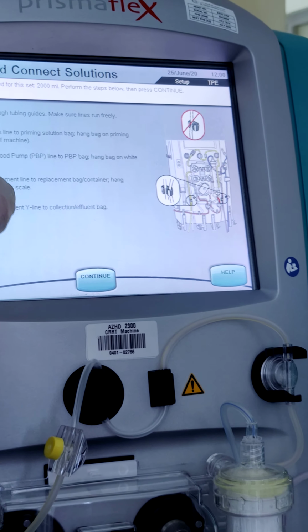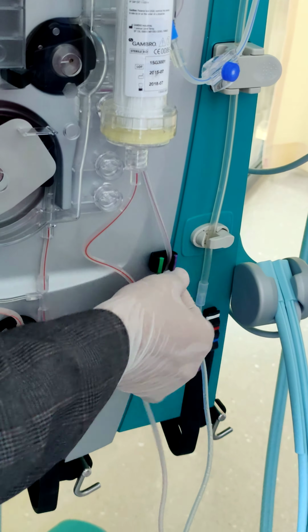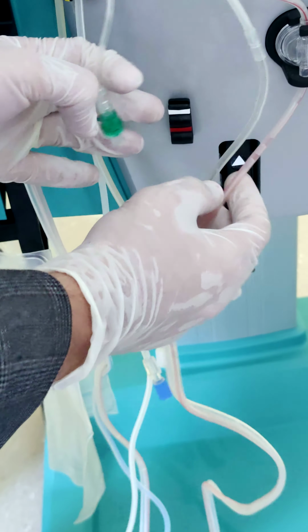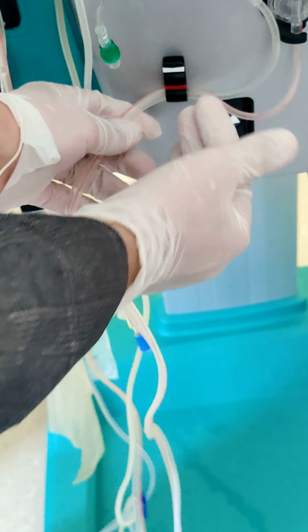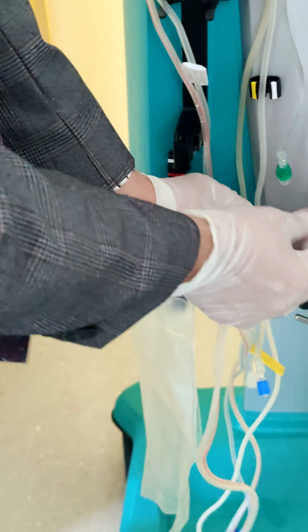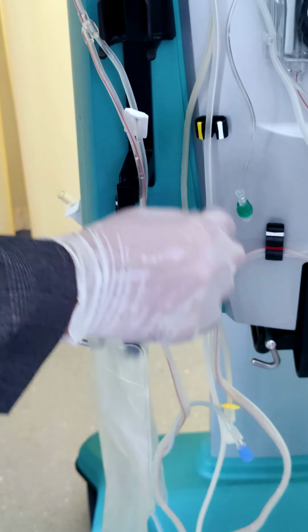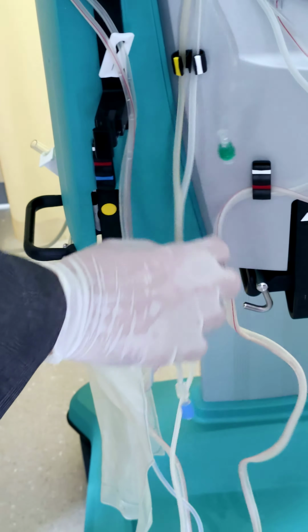Okay, now route lines through the tubing guide. Same thing, you just have to check the color, put it in the line holder here. This one we can insert here, and this one we can put here like this if we want, if the patient both together. It's coming together. But the important thing is to be free, not kinked. This one white with white, yellow with yellow. Okay.